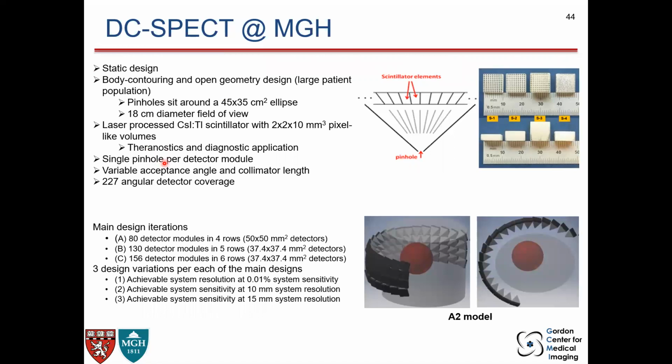Detector fabrication is automated, with very precise laser processing, so you can have detectors ready in a much faster time. That means lower cost, and you can apply it to conventional crystals, which are cheap. So that was the goal of this project. It's not in the market; it's an ongoing project.